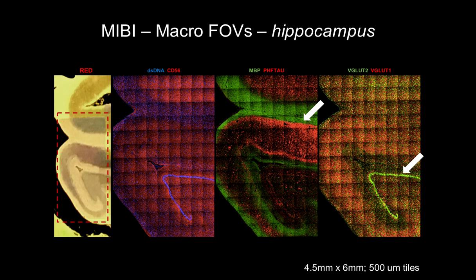And again, on the left and right here, you can see the distribution of the different neuronal markers, and you get things like VGLUT2, which is the perinuclear marker that marks the neuronal band going around the hippocampus here as well. And again, here on the left is a light-based image of the area that was scanned, mounted on our gold slide after staining.